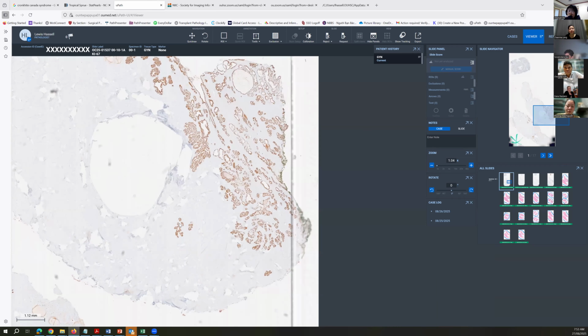So just out of academic interest and potentially a little bit out of prognostic interest, I have requested the other block that had the other patterns so that we could determine whether or not those are also HPV P16 reactive or have other characteristics like that.